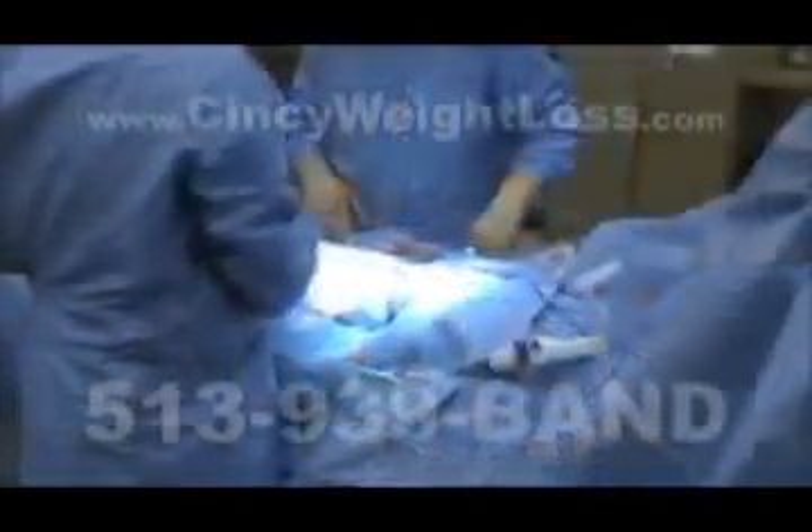Patients are prepped for surgery and general anesthesia is administered. The surgical team performs a final check of the instruments and equipment prior to commencing.